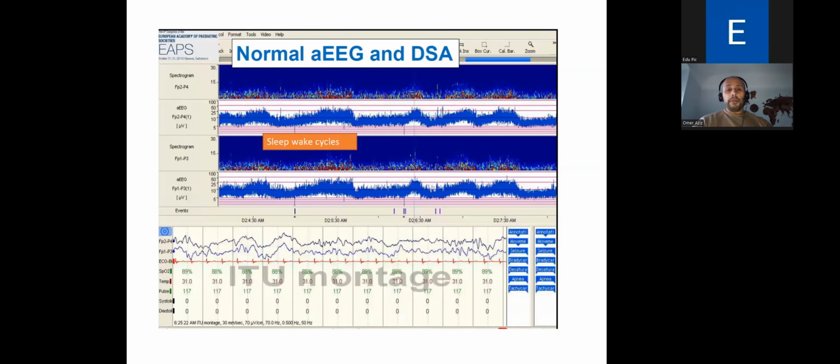So again, this is an appropriate label. This is again a normal CFAM, although you can say that there's some fluctuation, this sort of undulating appearance of the baseline. That is seen as a result of the patient's sleep-wake cycling, and so you can see it's just naturally curving up and down. This is actually a good prognostic indicator post cardiac arrest, for example. So equally, it's important to recognize, but you wouldn't treat these as seizures.